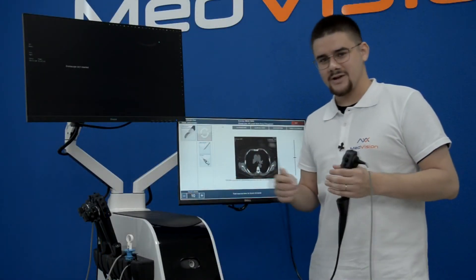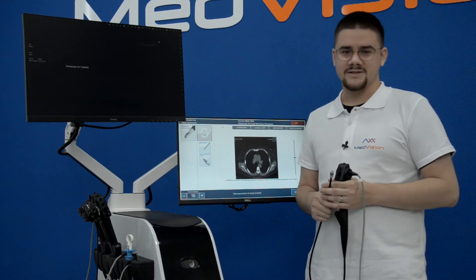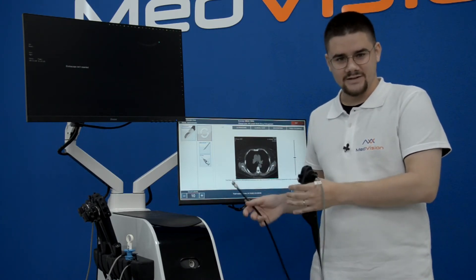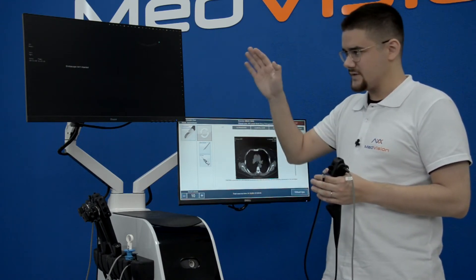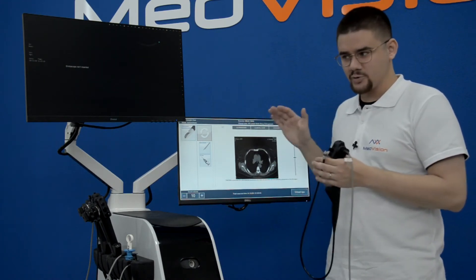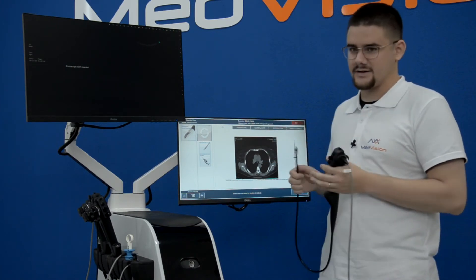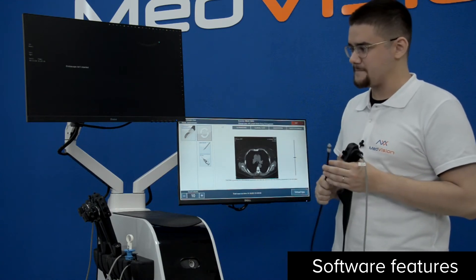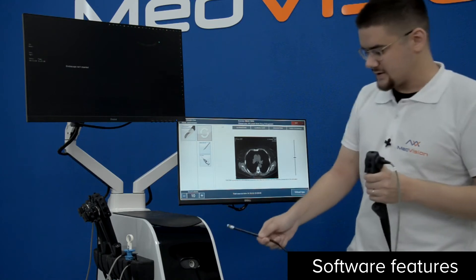MedVision as a simulator manufacturer keeps up to date with the latest techniques and developments in endoscopy diagnostics and simulation. We would like to have a closer look at the software interface on the example of the eBus TBNA module, and I will do a little operation of the simulator while we talk about the different controls.